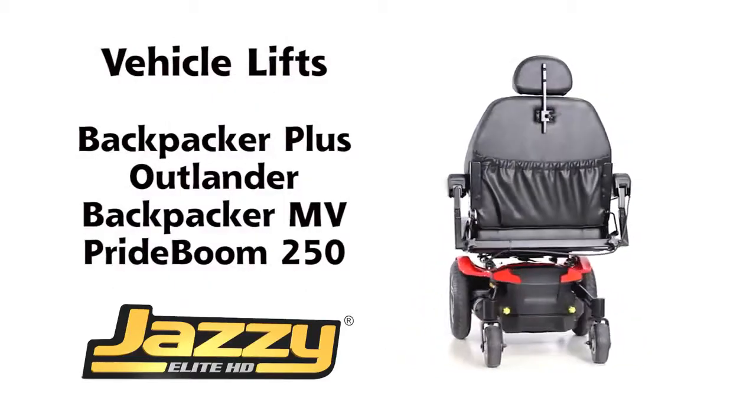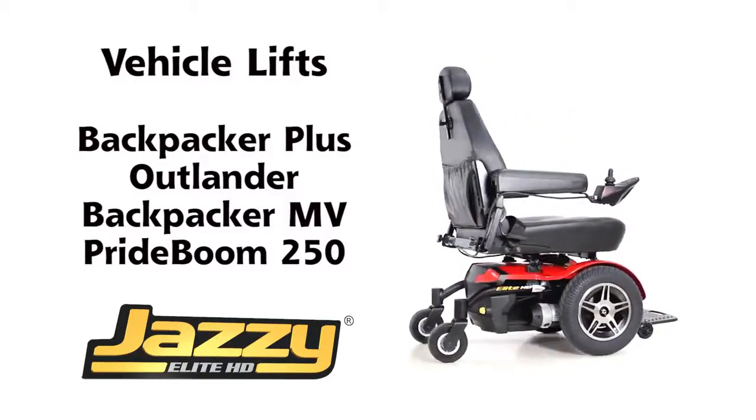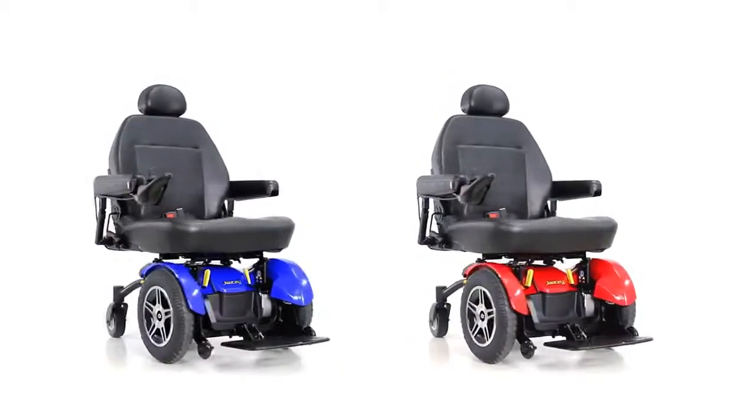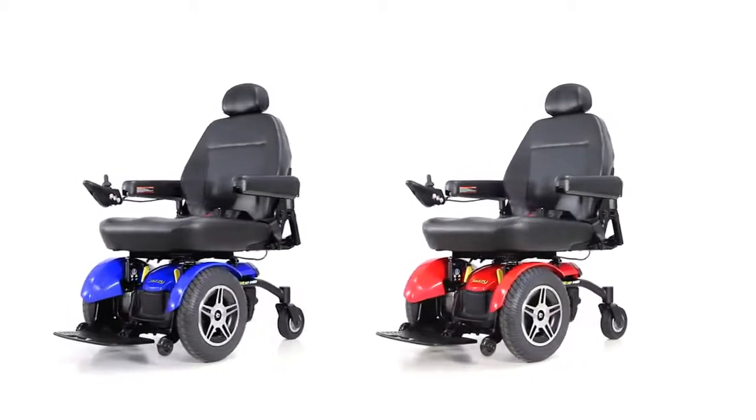Recommended lifts for the Jazzy Elite HD are the Backpacker Plus, the Outlander, the Backpacker MV, and the Pride Boom 250. Two color choices are available on the Jazzy Elite HD, including red and blue.